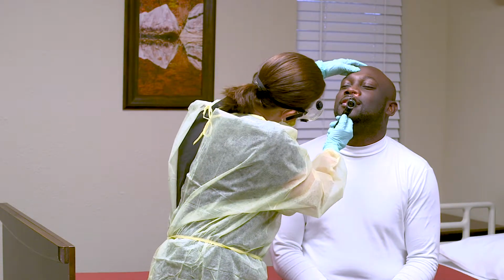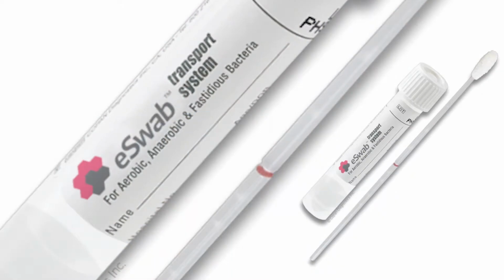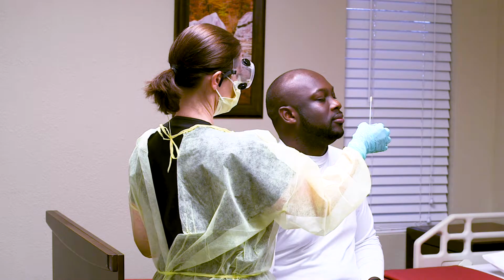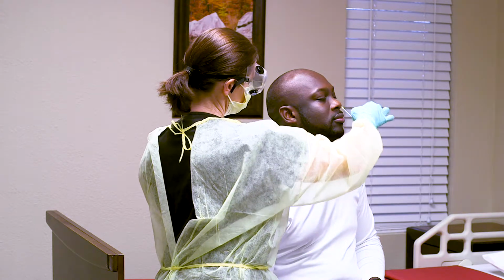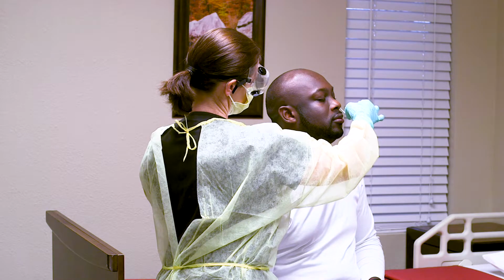Next, check for nasal obstructions. Open the eSwab sample collection pouch and remove the tube and swab. Collect the sample from the patient by doing a nasopharyngeal swab with the swab included in the kit. Gently insert the swab into the nostril, keeping the swab near the septum floor of the nose. Gently push the swab into the posterior nasopharynx.